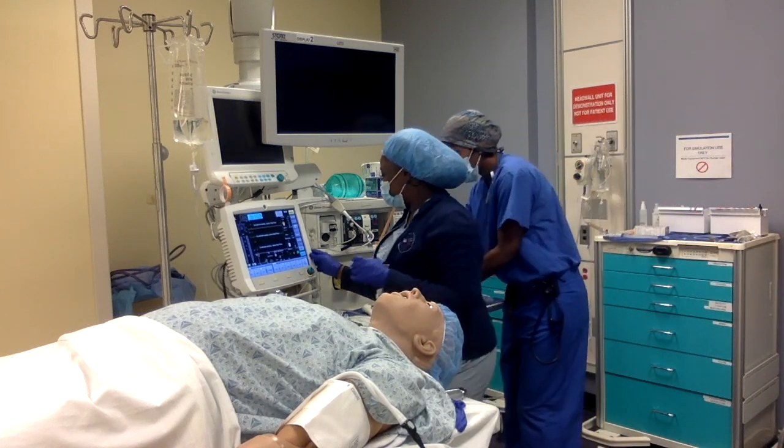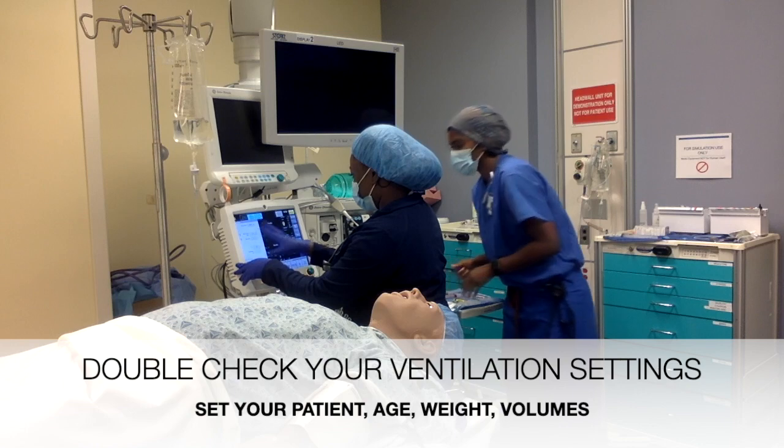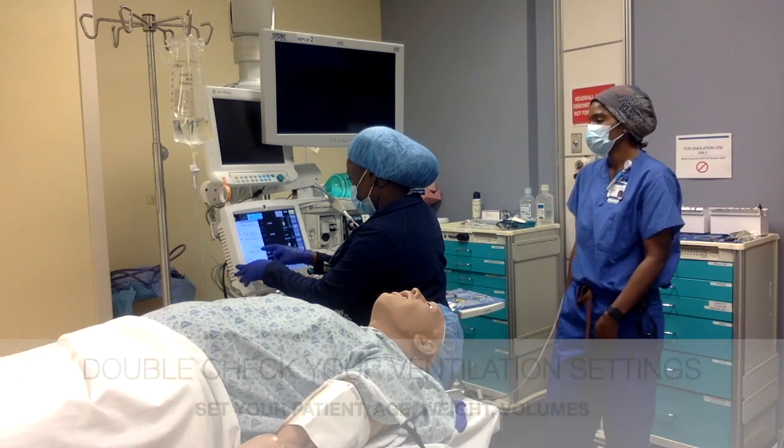Once that's done, we're going to make sure we have our appropriate settings for our patient.